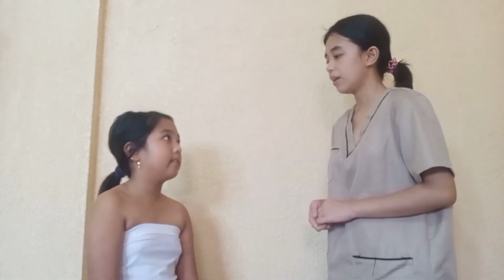So ma'am, may I know your name? Aina. And when is your birthday? September. And how old are you, ma'am? 10. Okay, so after that, I am going to explain the procedure, why the procedure is necessary, and how the client can cooperate.